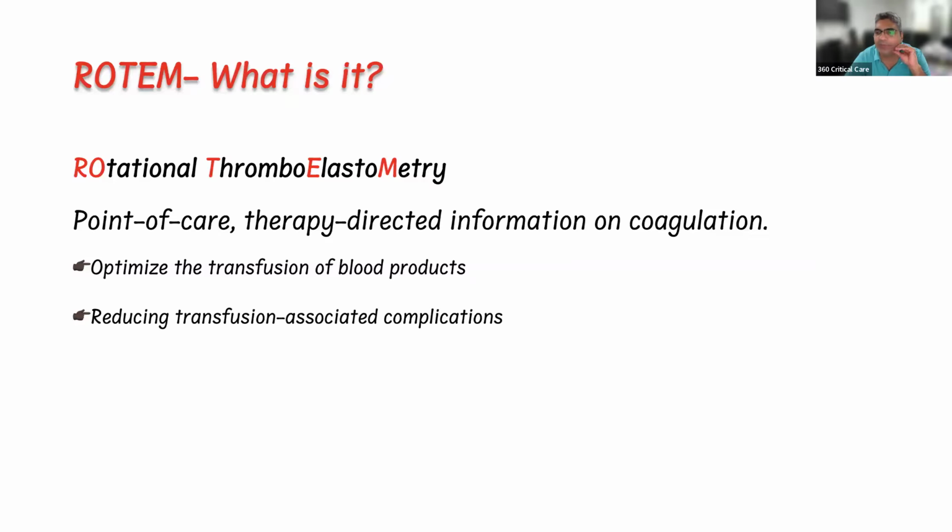So in this session for the next half an hour, we'll be talking about ROTEM. I'll go through a little bit of the basics of ROTEM so that you will be acquainted with what it means, and if you are given a scenario, how to interpret it.